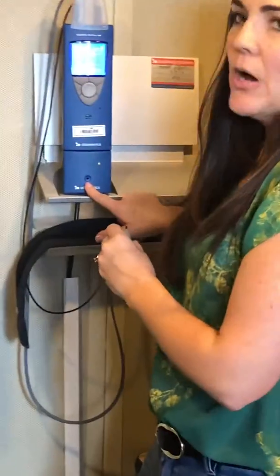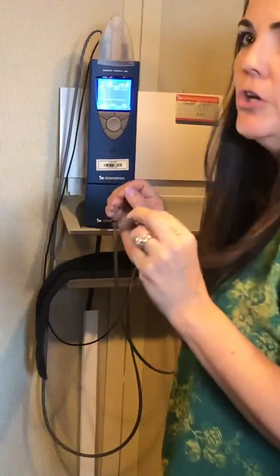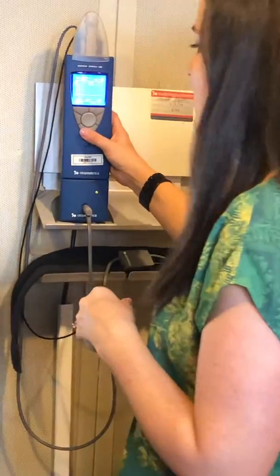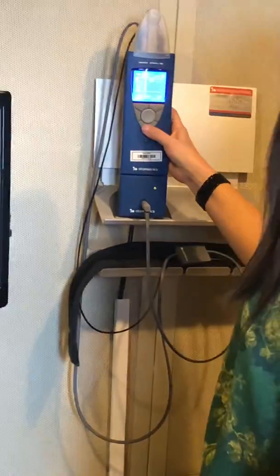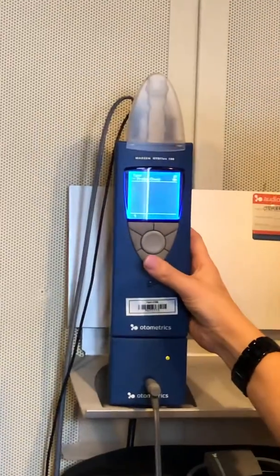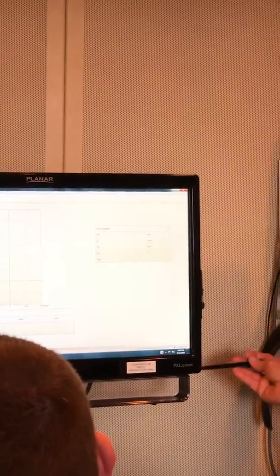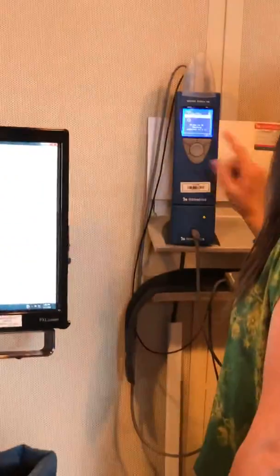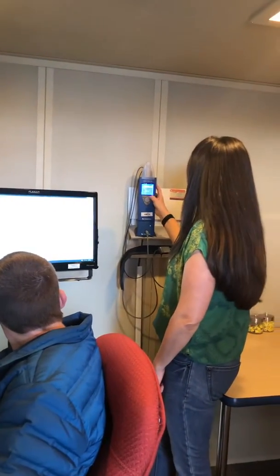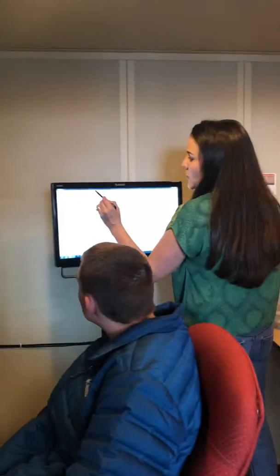Another thing we need to do for the first time each day is calibrate. This is a 2cc coupler, which is basically an artificial ear — we're measuring just to make sure the device is functioning okay. I push the bottom button, probe check is highlighted, I push that button, and then it does a reading and says 'probe is okay, adjusted to 2cc.' Self-test is good, ready to start.